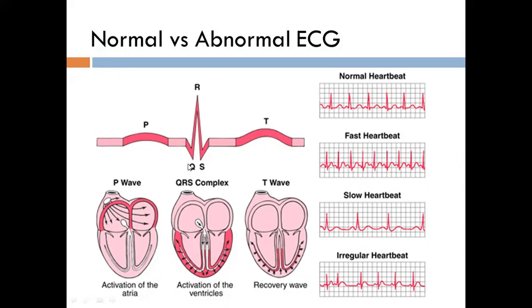And the QRS complex is produced because of activation of the ventricle. This is the ventricle. I'm not going to explain action potential, depolarization, and repolarization right now. To make it easy, it is contraction of the ventricles, right? That is the complex. And the T wave, a positive deflection, is produced in the recovery phase.